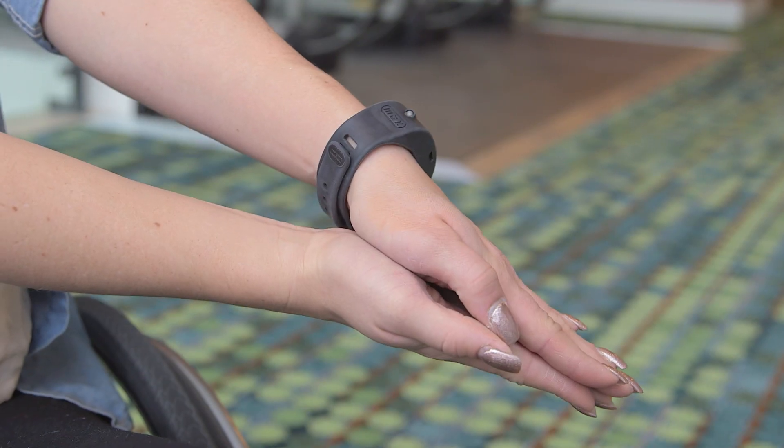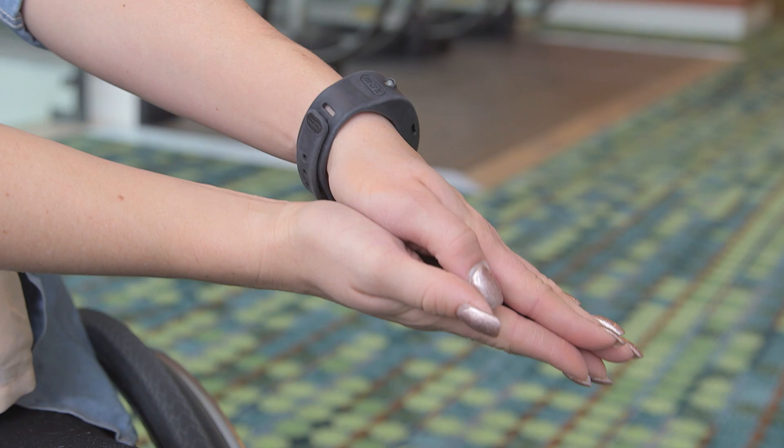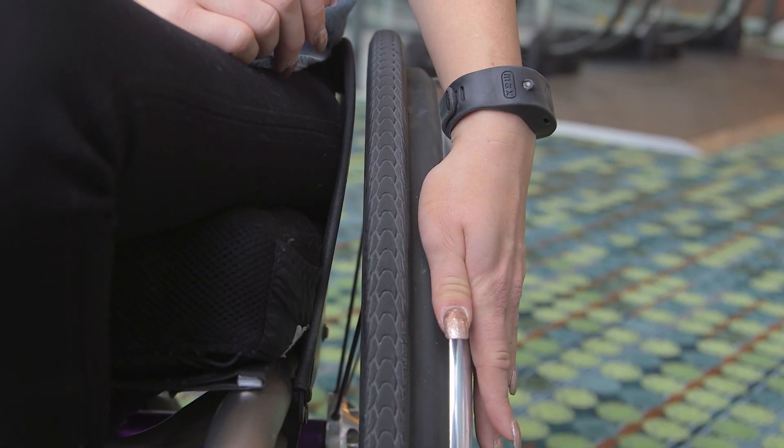The Bluetooth wristband works like a Fitbit in that it monitors the motion of your wrist. It's looking for a tapping motion or a quick change in speed. You tap against the push rim because your hands are already there for steering and braking.